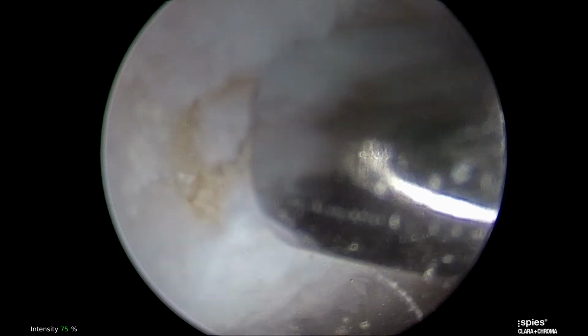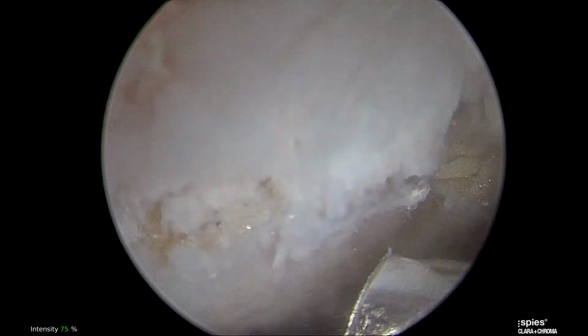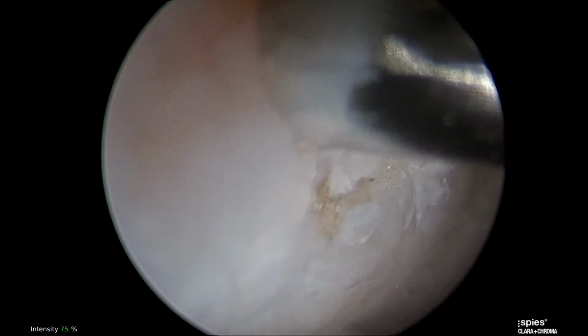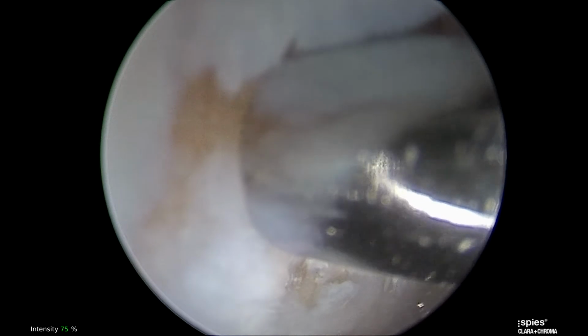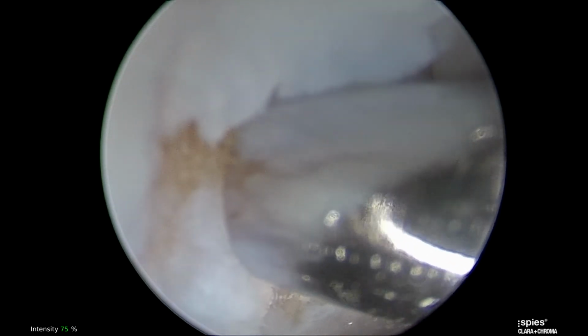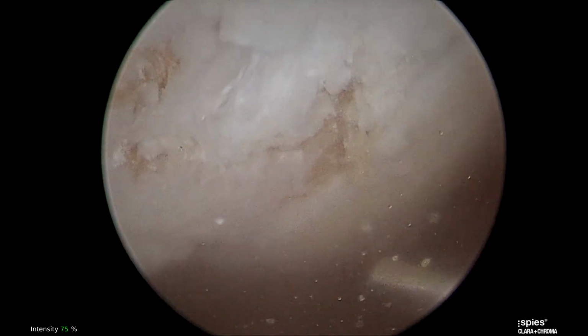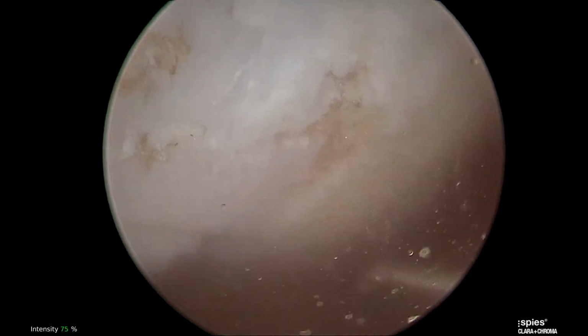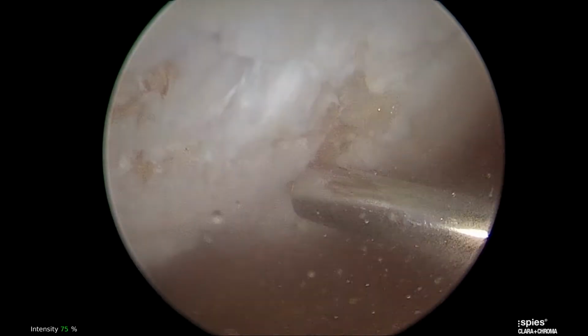There's another little full thickness defect over here. And then again, just go ahead and fire the device. It makes a little needle hole there. You can see a little puncture hole. And then there's a couple of other little areas there. Again, fire the device, and then we'll get the ability for the pin to just easily extract. So you got these little needle holes.